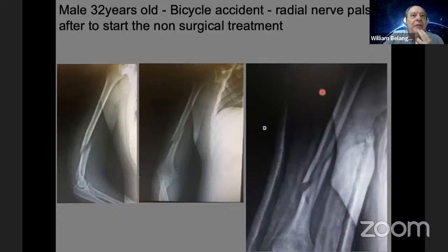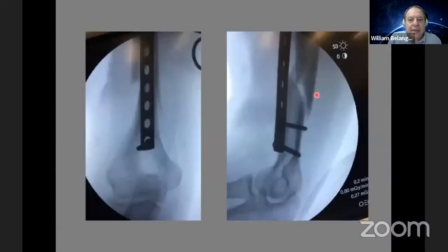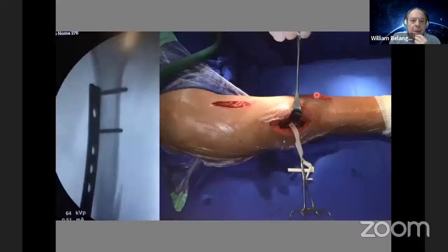We have 2 kinds of distal fractures. We have a distal fracture in which the distal bone fragment allowed us to fix at least 2 screws in the anterior aspect. This is distal, but it is a very easy fracture to treat by a conventional technique, like in this case. We use 2 screws. We put these 2 screws side by side in the distal fragment.